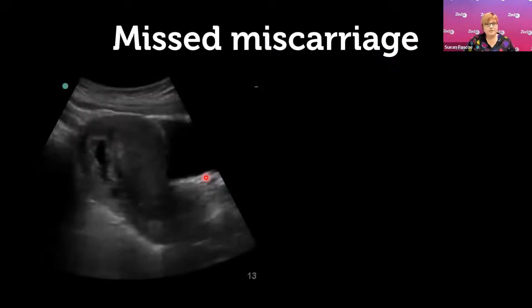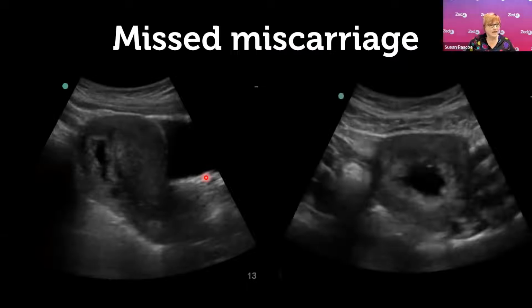Sometimes it's a missed miscarriage, so the body just hasn't recognized that it's not progressing normally to pass the products of conception. So what I'm looking for in a missed miscarriage is the size and the shape of the gestational sac. So remember, our gestational sac, once it's bigger than 25 millimeters, I should always see the yolk sac and the crown rump length. So what I'm looking for here, in this instance, the average or the mean sac diameter here ended up being about 32 millimeters, and we couldn't see a yolk sac or a crown rump length at all. So we could categorically say that this is a missed miscarriage.